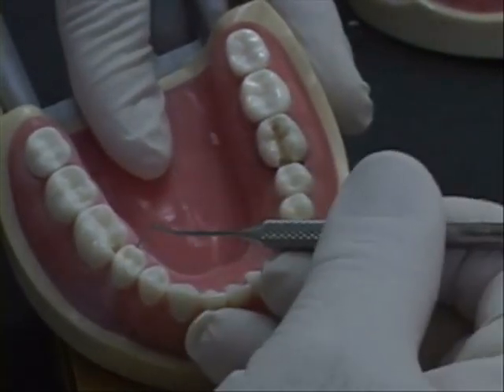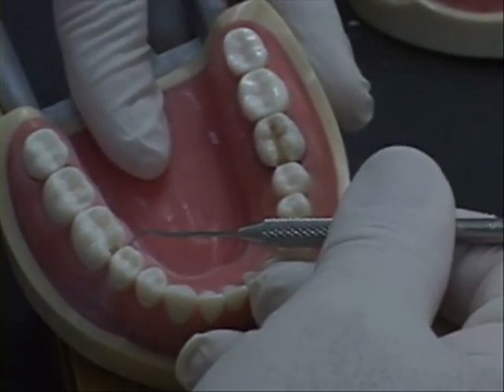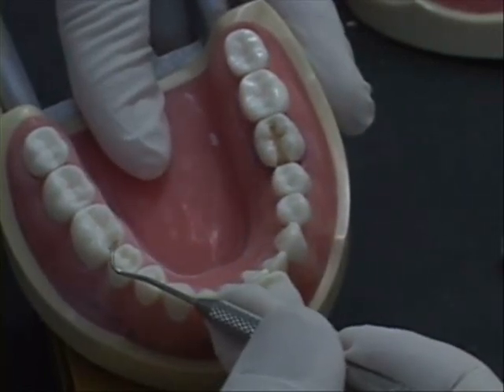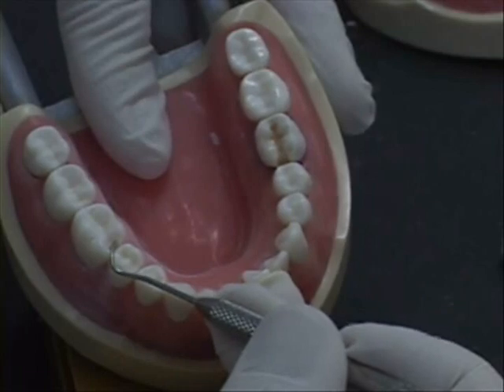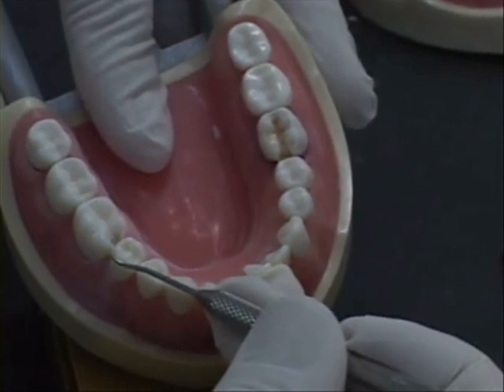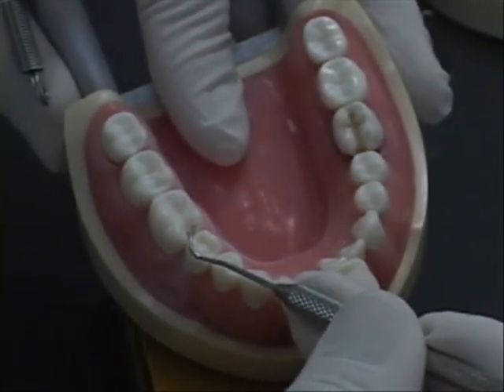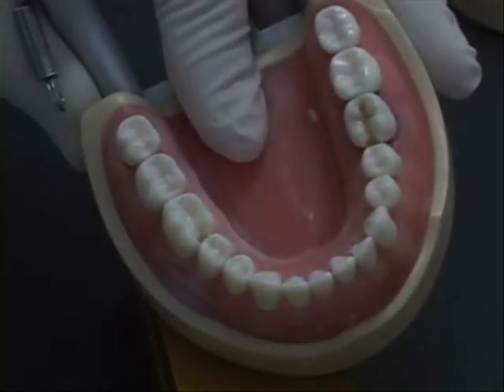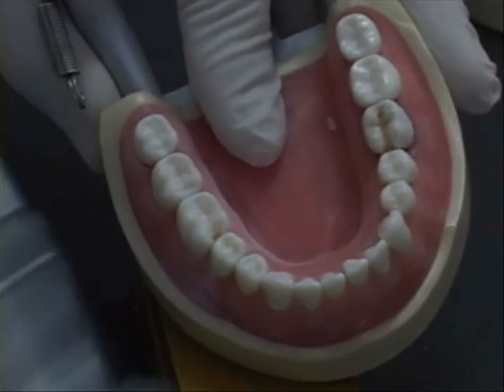I get this underneath here. See, the tip of the explorer goes through. Now look at my lingual extension. Looks like if I plane away this little triangular area here and get rid of this undermined enamel, I have a perfectly straight contour that comes out to my extension. Again, my facial seems to be a little short, so I gotta go and extend my facial.